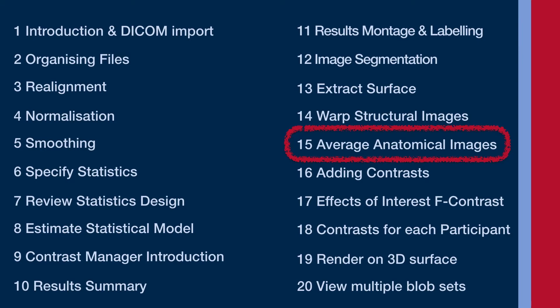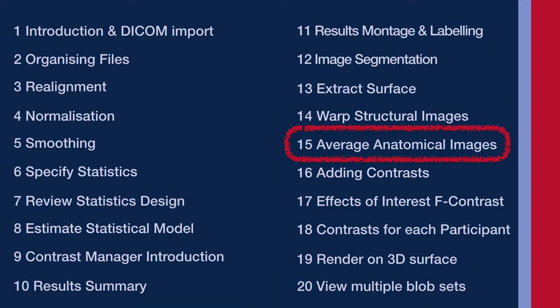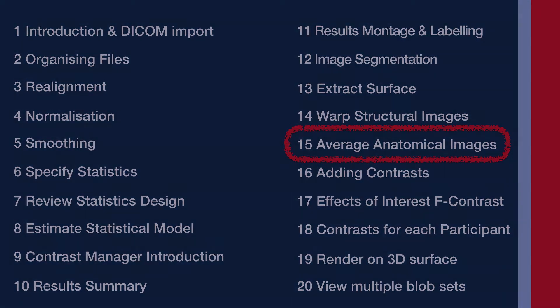First, you can see how even the average of just a small number of structural images looks quite blurry and shows the limitations of normalization and how you lose spatial accuracy. But also it introduces the image calculator and performing simple manipulations on different images such as taking the average and entering an evaluated expression. It's useful to know it exists even if you don't do it often.